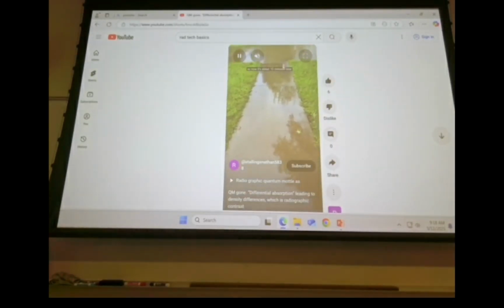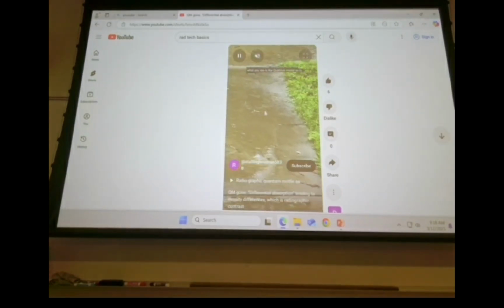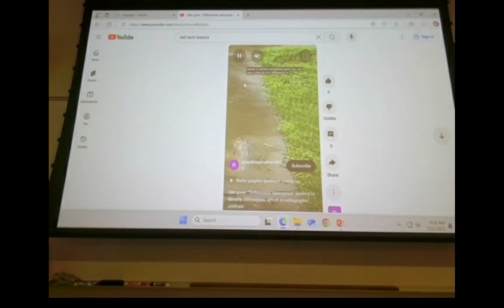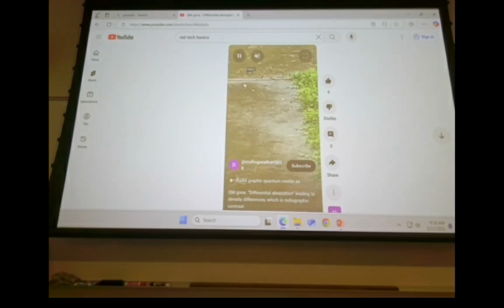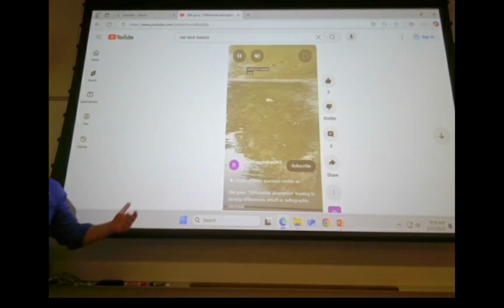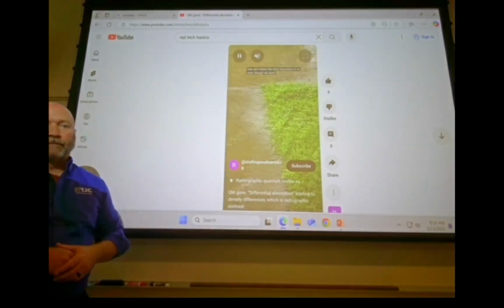So it's rained a little bit more and quantum mottle's gone. Your entire image receptor is filled with stuff. Now, at the opposite extreme of this, and this is kind of what this is showing really fundamentally, you can overexpose to the point that everything looks the same. All right.